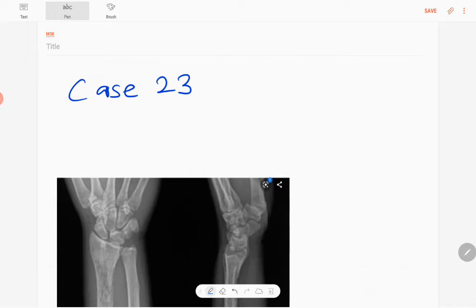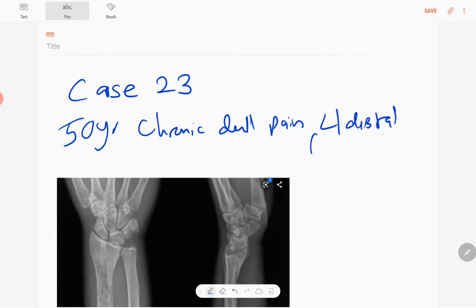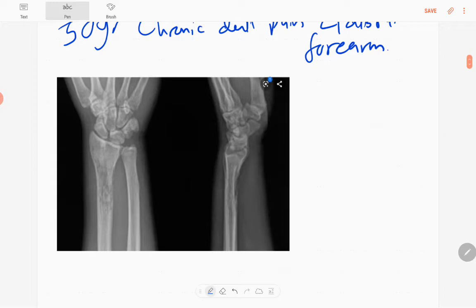Hello everyone, this is case number 23 of the MSK series. Today's patient is a 50-year-old presented with chronic dull pain in the left distal forearm. These are the anteroposterior and lateral radiographs of the left distal ulna and radius including the wrist joint in a skeletally mature patient.